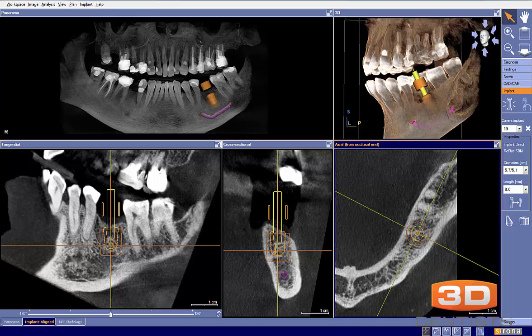Thanks for sending this case in. This is a case just submitted and we want to take a review. It looks like it's site number 19, and it looks like the tooth has been missing for some period of time. So let's take a look at what's going on here.